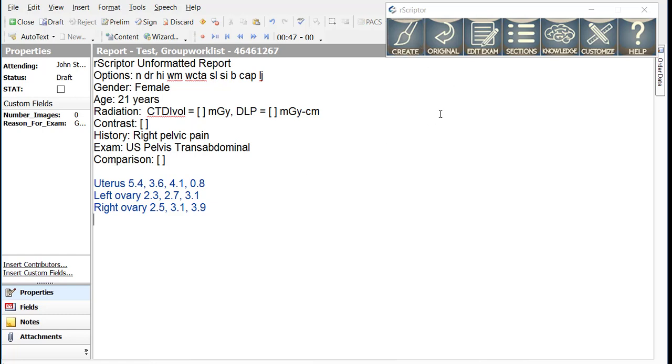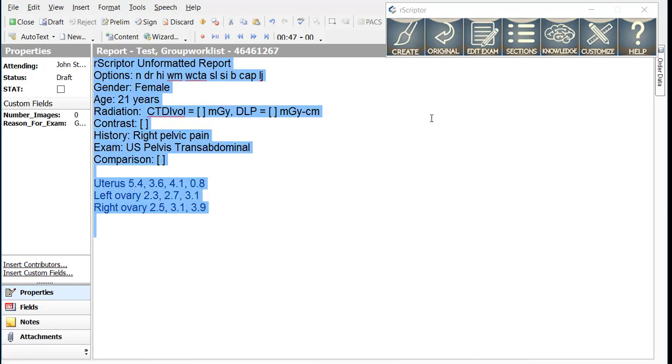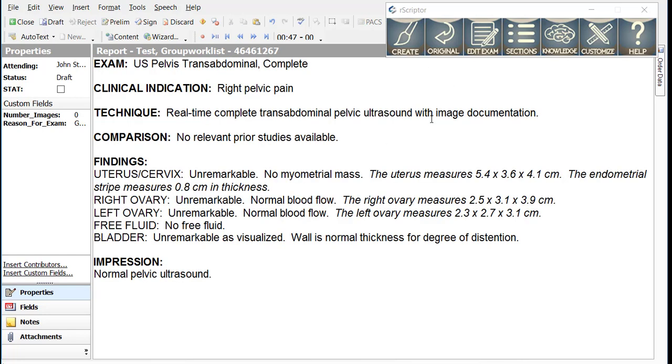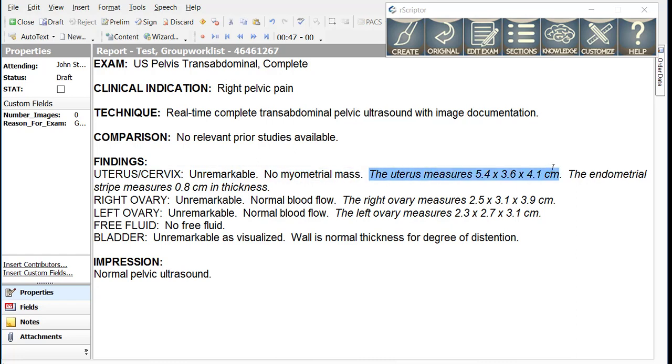If I create this report, you will see it will be filled in with the appropriate dimensions of the uterus, the endometrial stripe, and the ovaries.